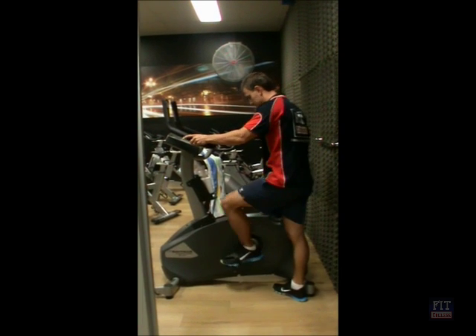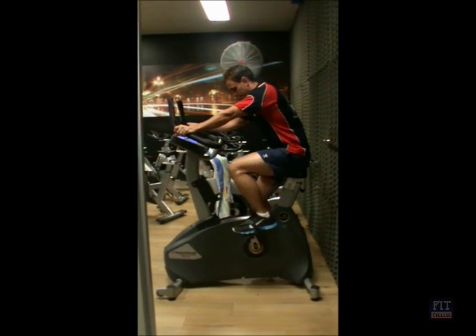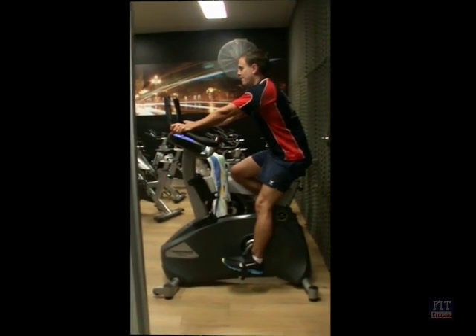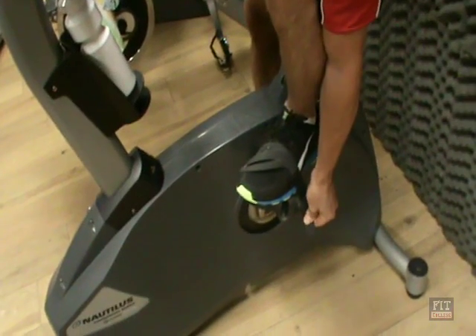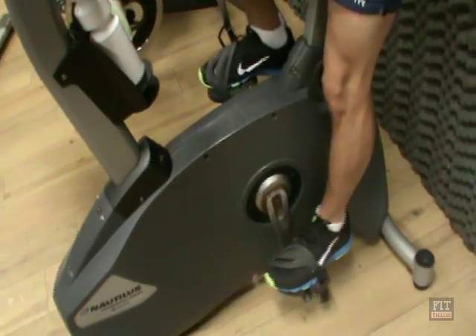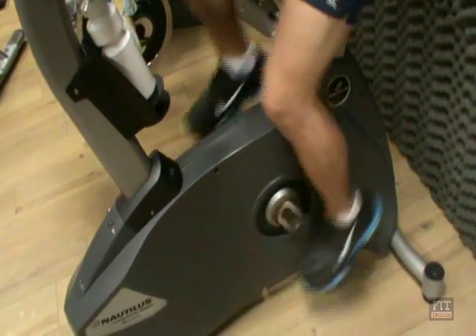First of all you will need a cycle bike with a display setting for watts and RPM. We need to set up our client so that at the bottom of the cycle there is about a 5 degree bend in the knee. Once that's set up we can then adjust the feet, making sure the feet are firmly secure within the pedals.